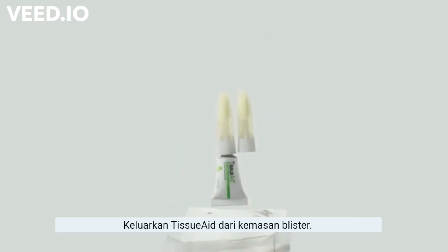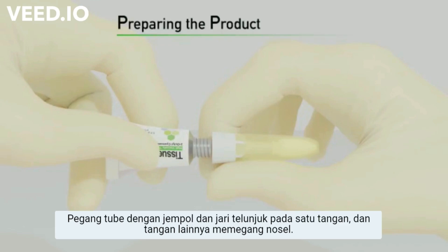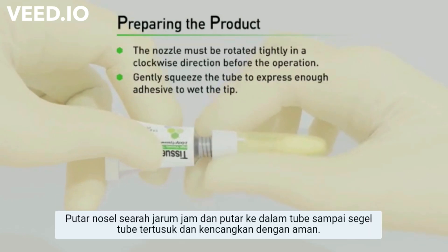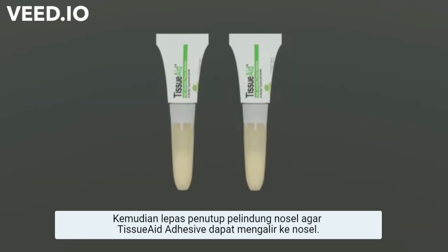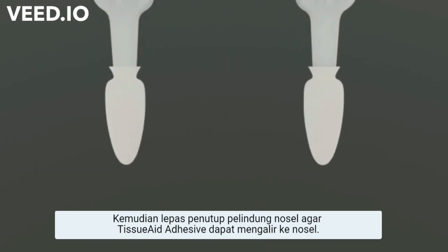Remove the Tissue Aid from the blister package. Hold the aluminum tube between the thumb and forefinger of one hand and the nozzle with the other hand. Rotate the nozzle clockwise and screw it onto the aluminum tube until the seal on the tube is punctured and it is securely fastened. Then remove the protection cap of the nozzle to allow the Tissue Aid to flow into the nozzle.